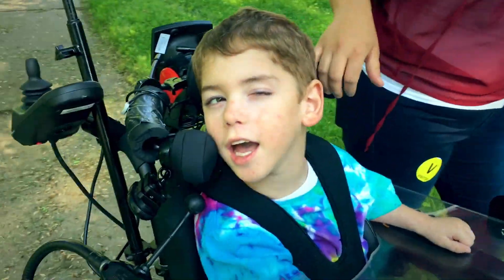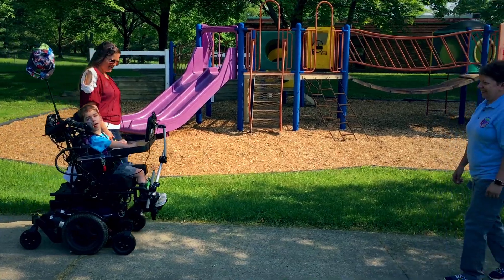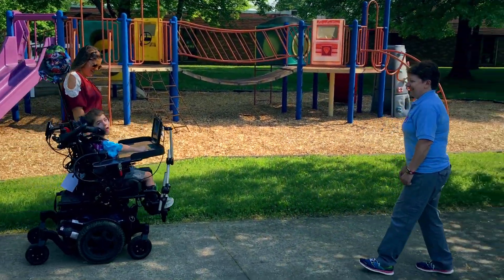You can do things on your own now. Here's Paxton in his Zippy power chair enjoying the beautiful sunshiny day out here at Happy Day School.